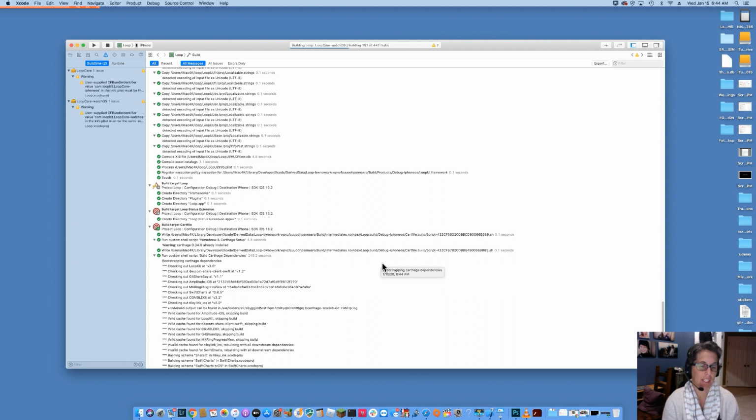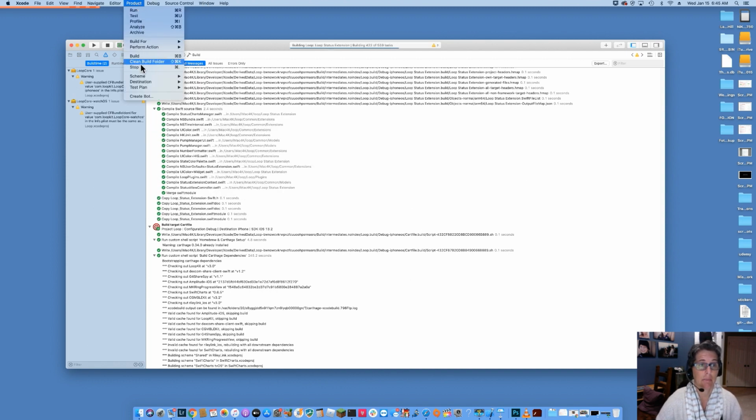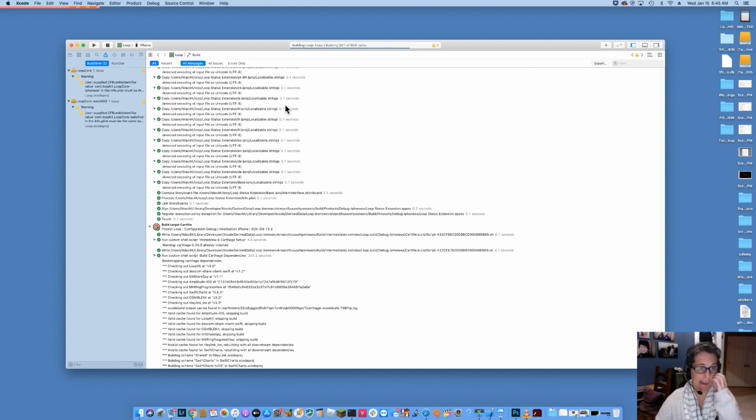So just wanted to say that's the way that you should start resolving your build errors at first: go up, check to make sure that you have a current version of Xcode, that you're all up to date, and then check that your command line tools are entered in that drop-down menu under Xcode Preferences Locations tab. I do a product up here, clean build folder, and then build again. If the error doesn't resolve after that, although in this case it did, then we do a next set of troubleshooting, and that would be through Loop Docs.